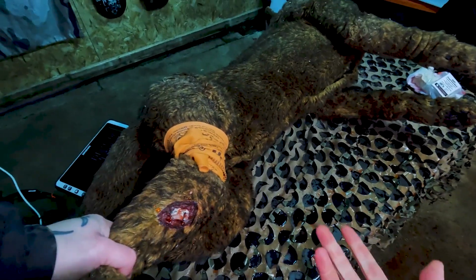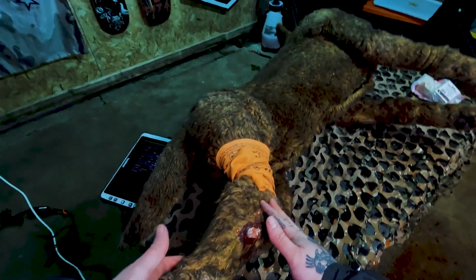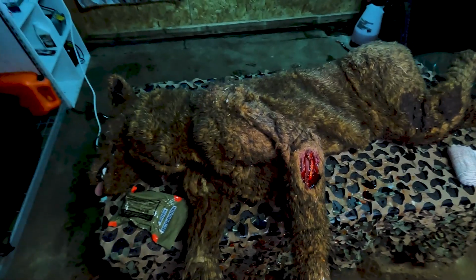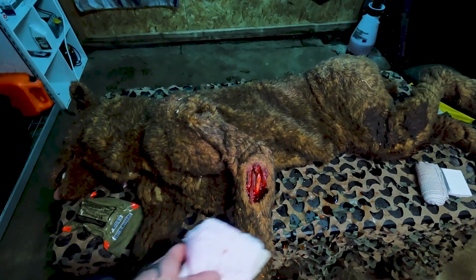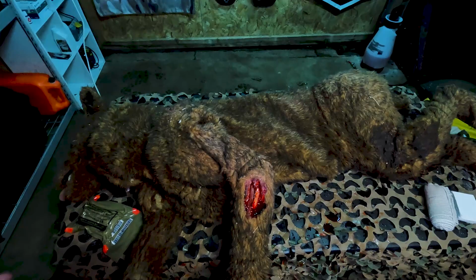And tuck it underneath. So you could probably hear the pump still going. It's really not that hard to stop the bleeding in this canine mannequin, and it is more difficult to stop it in him than an actual 70-pound working canine. After covering, it might be better to use a SWAT-T or Ace bandage to create a tourniquet effect on a canine extremity that's bleeding profusely or has a traumatic full or partial amputation.